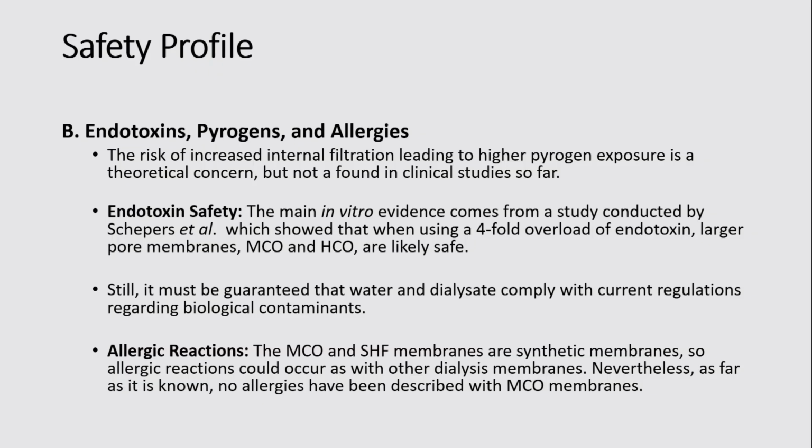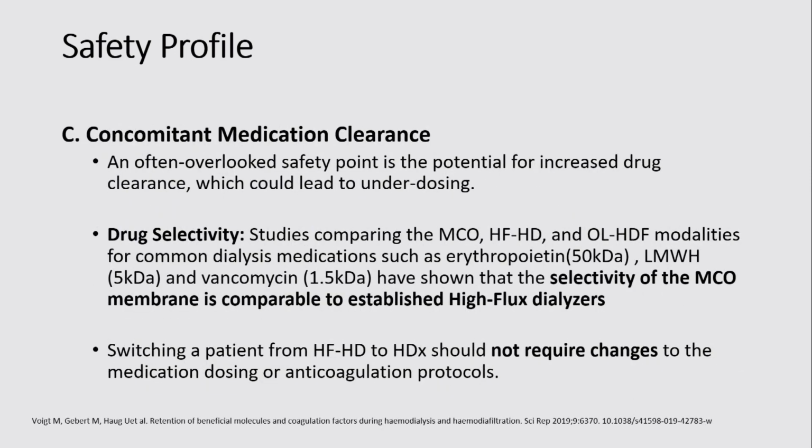Regarding allergic reactions, it has not been found to have any excessive allergic reactions compared to those which regularly can happen in any dialysis session. Regarding concomitant medication clearance, there is no recommendation to change any medications when patients are being switched from high flux dialysis to expanded hemodialysis.